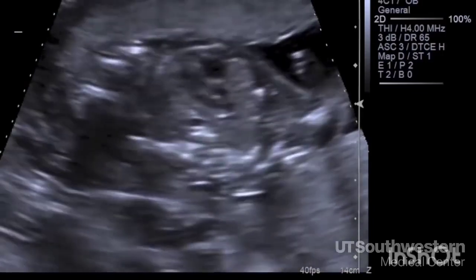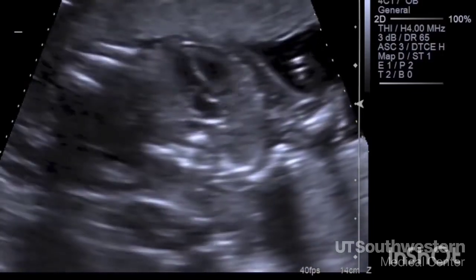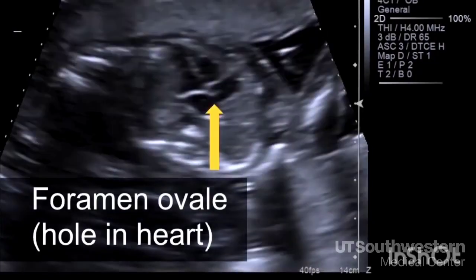That allows us to see the 4 chambers of the heart, valves opening and closing, and the blood vessels leaving the heart. There's a hole here between the right and left sides of the heart. It allows oxygenated blood to take a shortcut from the right side of the heart to the left side and bypass the lungs, since oxygen is being provided through the umbilical cord. That hole will close after a baby is born.